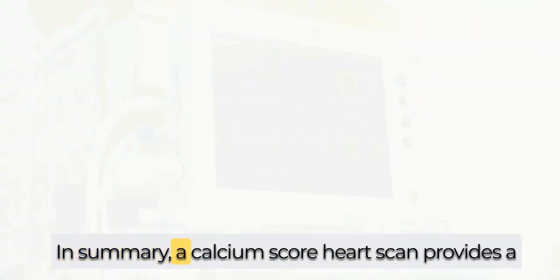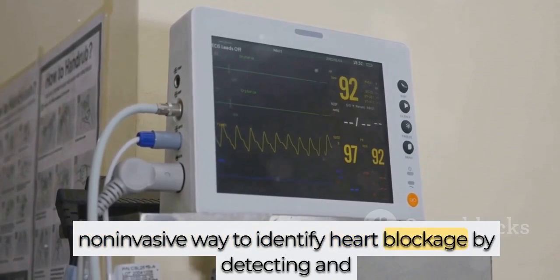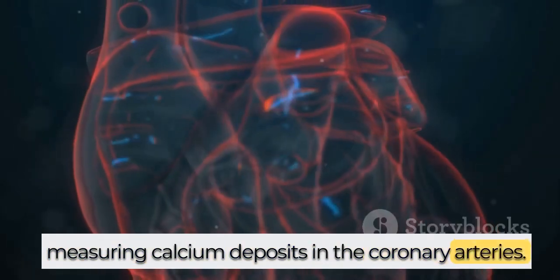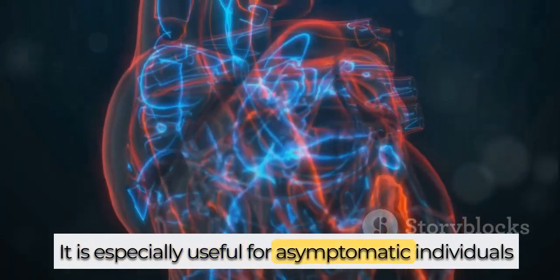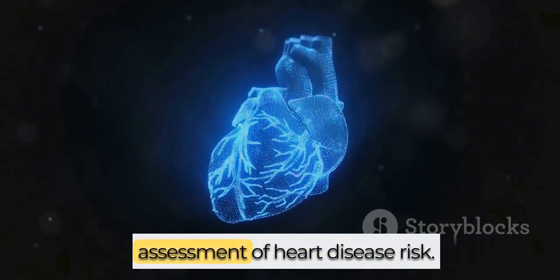In summary, a calcium score heart scan provides a non-invasive way to identify heart blockage by detecting and measuring calcium deposits in the coronary arteries. It is especially useful for asymptomatic individuals at high risk of heart disease. However, the scan has limitations and should be used as part of a comprehensive assessment of heart disease risk.